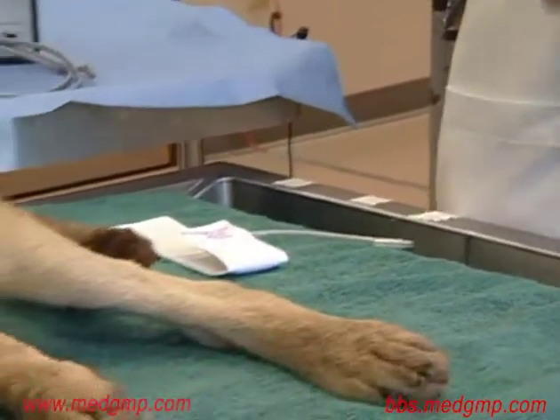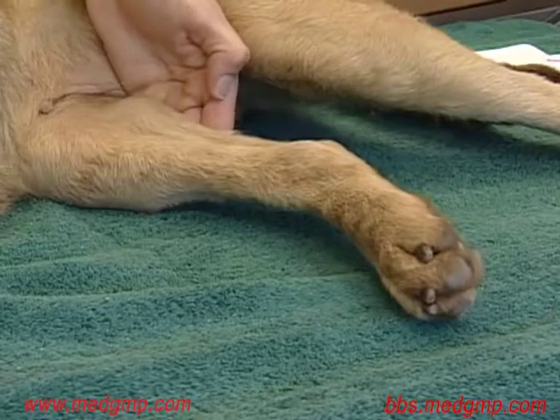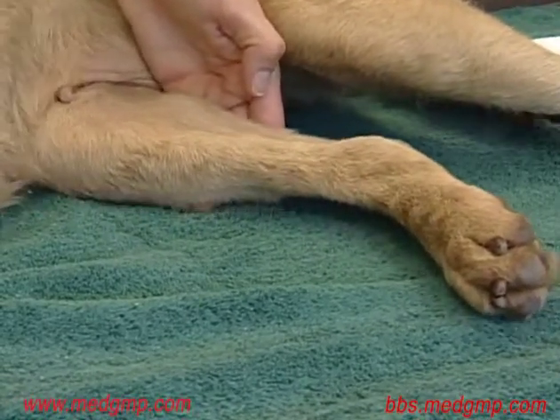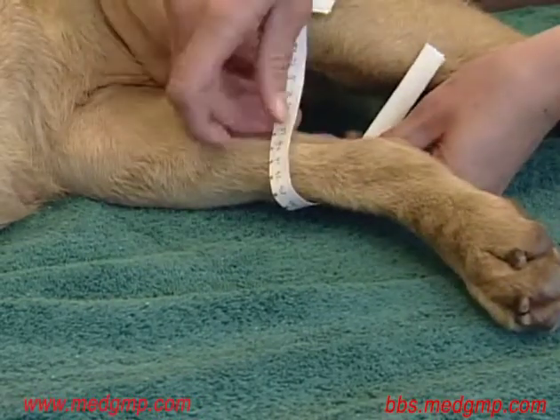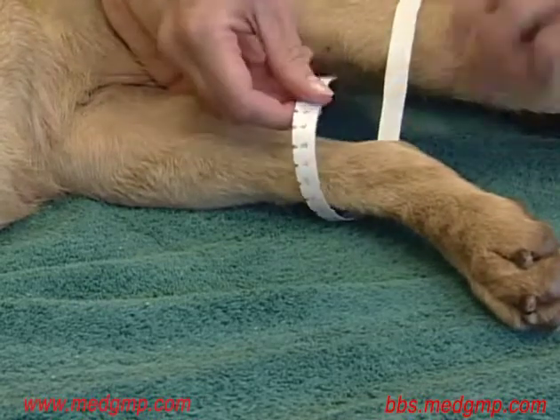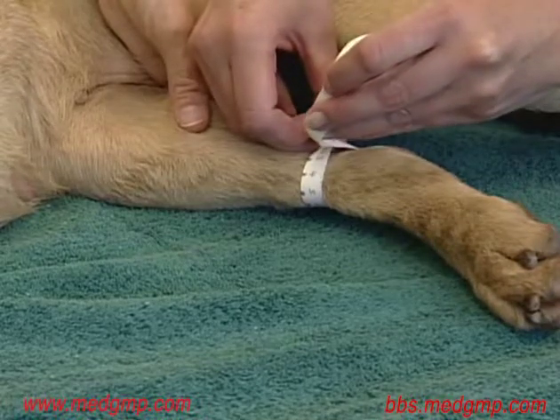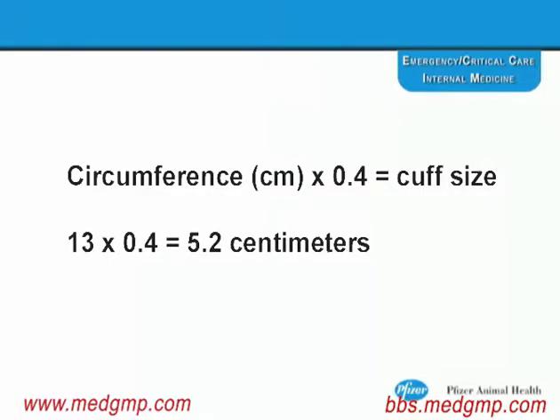One of the first things we like to do is measure to determine the cuff size. In this case, we're going to use the dorsal pedal artery, so we're going to measure above the tarsal joint. We're measuring the circumference of the limb in centimeters — about 13 centimeters in this dog. We multiply this value by 0.4 to determine the cuff size, which comes out at 5.2 centimeters. Therefore, we're selecting a 5 centimeter cuff.